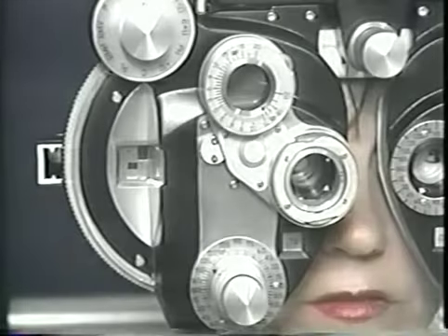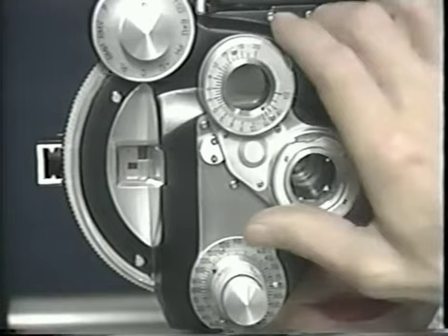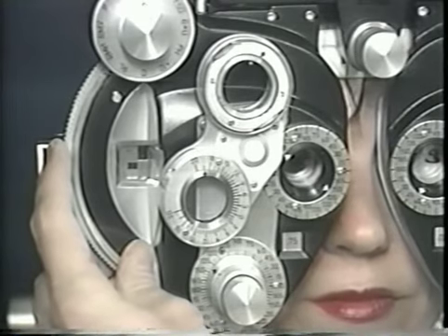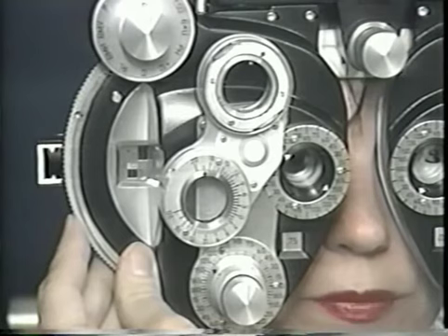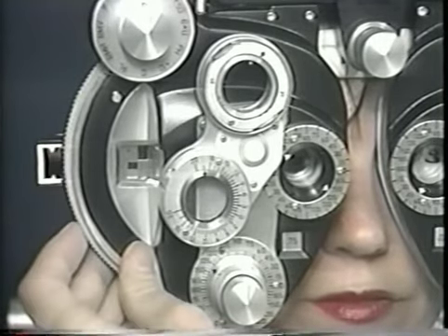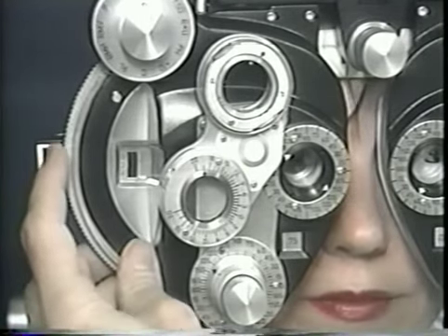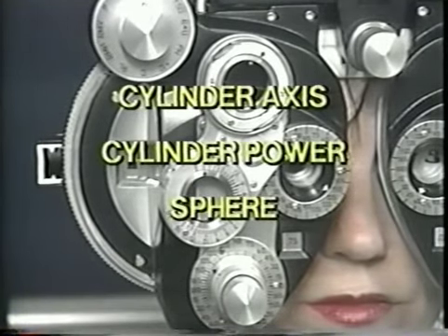Good. With refinement of cylinder power completed, the cross cylinder is removed and sphere is refined for best visual acuity, testing in the plus direction first as before, and then in the minus direction if necessary. If any significant changes are made in cylinder axis, cylinder power, or sphere during the refinement steps, the sequence should be repeated until no further changes are made. Again, the order of final refinement is always cylinder axis, cylinder power, and sphere.